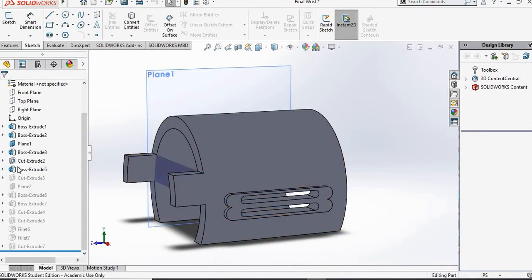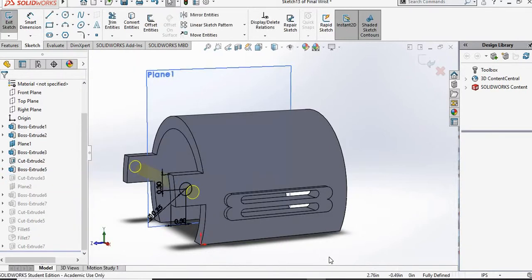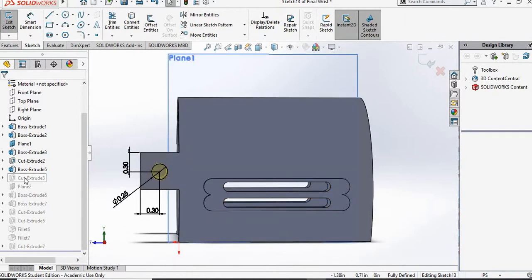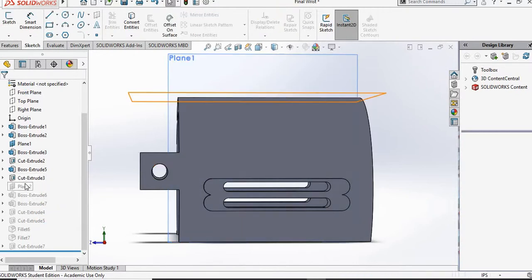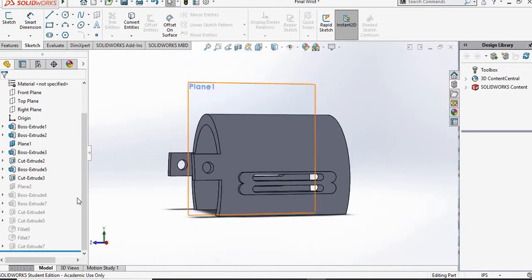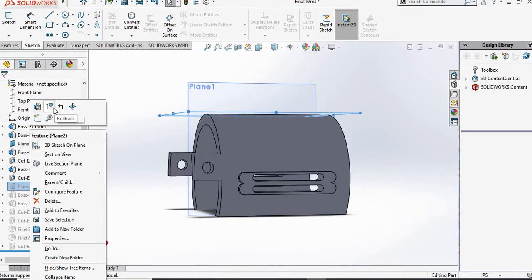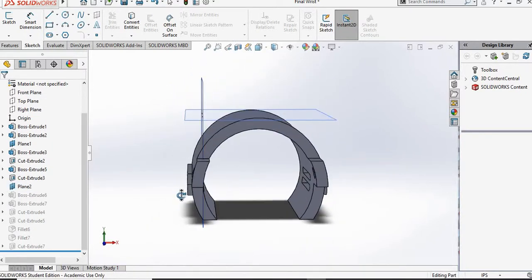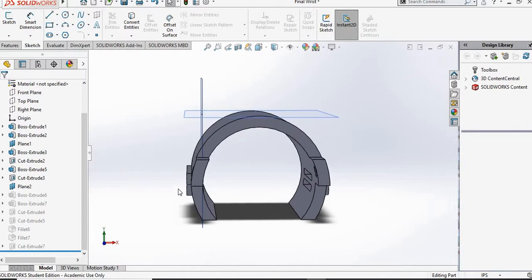After I made that extrusion, I went ahead and made a cut on it, and I made the cut for our holes so that our screws and bolts can go in here. Alright, and here are the dimensions for those holes. Again, 1/4 inch diameter. Alright, so after I made those 1/4 inch diameter cuts, I went ahead and created a reference plane using the top surface of our wrist bracket. And I did this so that we can add another feature on here.